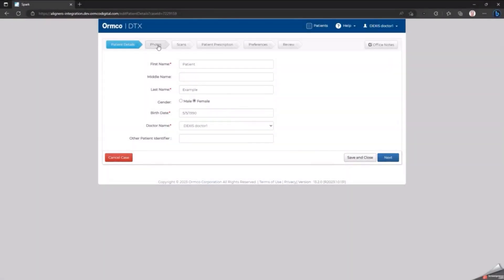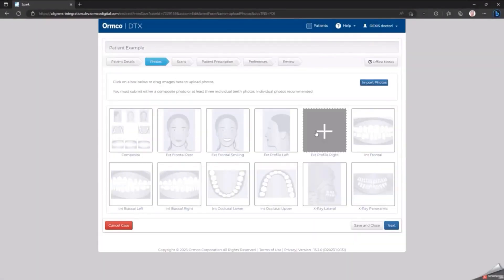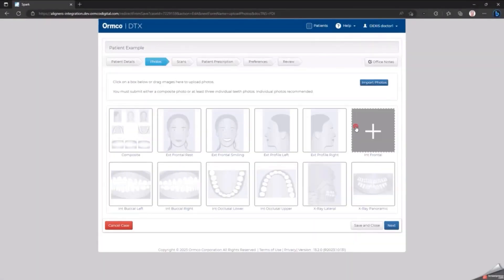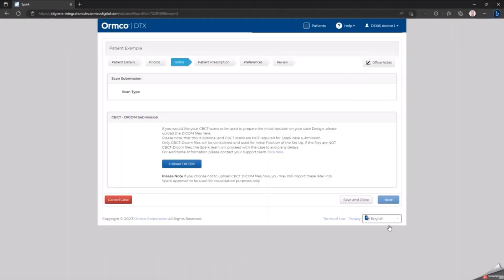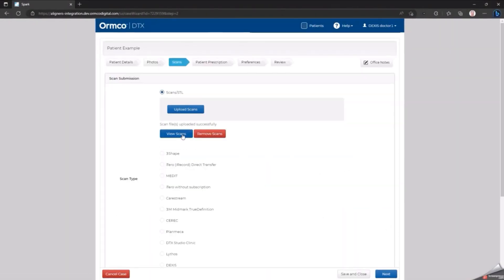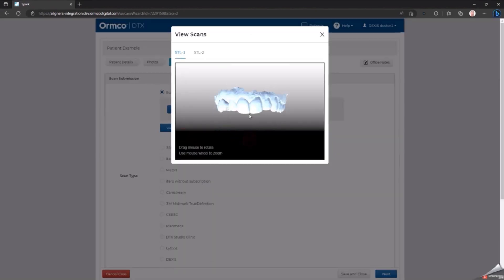Click the Photo tab and upload the patient's images. Then click the Scans tab and click View Scans to confirm that the STL files are present.